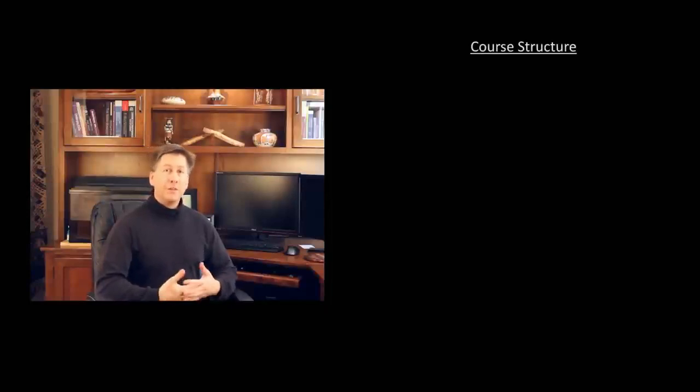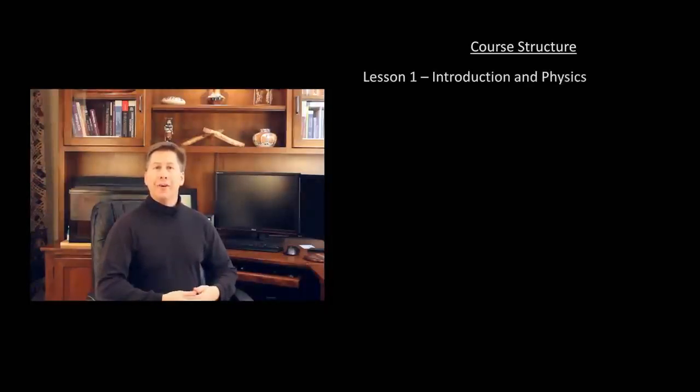The course will have 10 videos. Here's the structure. Lesson 1, that is this video, will cover the fundamentals of how an X-ray is taken and the physics involved. Please don't let the word physics scare you away. It's really basic and includes some pretty pictures.